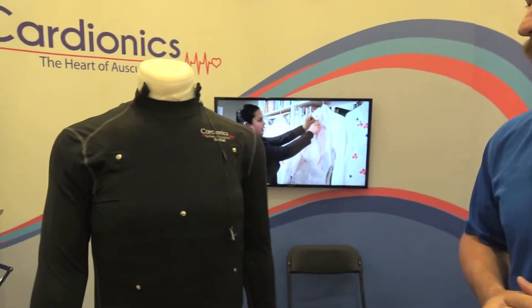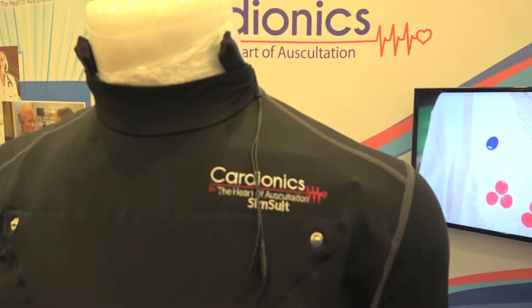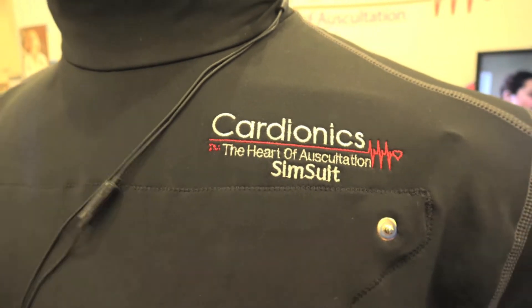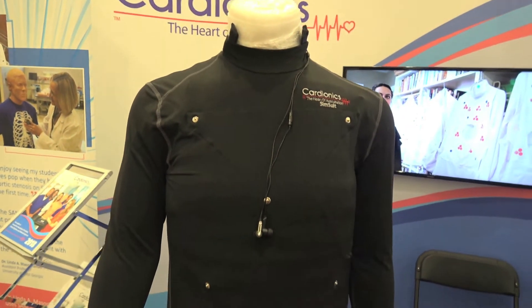This is our newest product, the SimSuit. The SimSuit is really an improvement upon the SimShirt. It has auscultation capabilities used in conjunction with our SimScope.